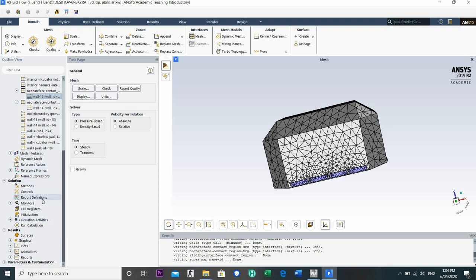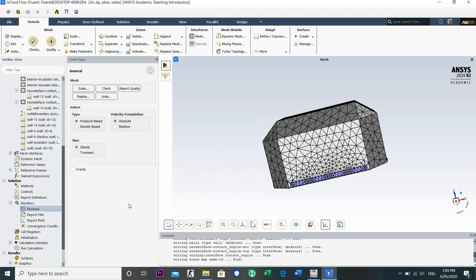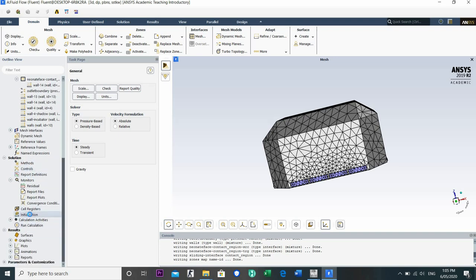And then it's really important to change the solution monitors. It is very important to set this to 1e-6 as the absolute criteria. This is the convergence criteria. It's very important, the convergence criteria. Okay, and the methods and controls need no changes.